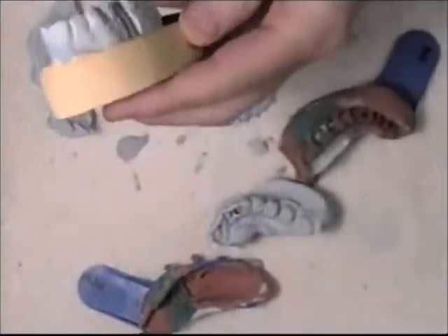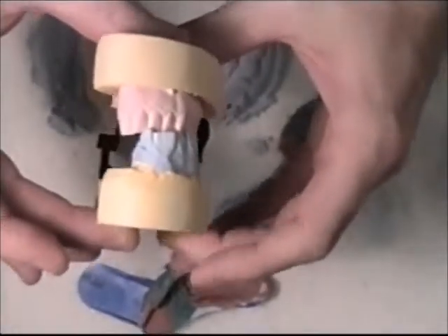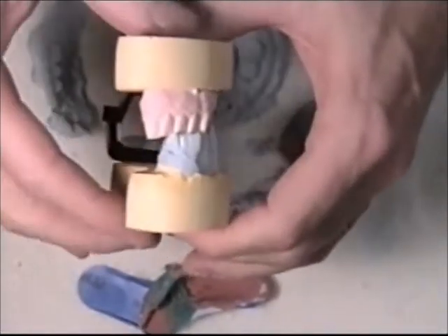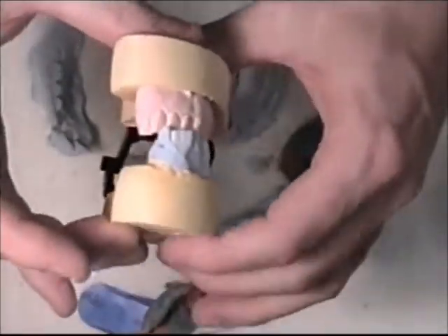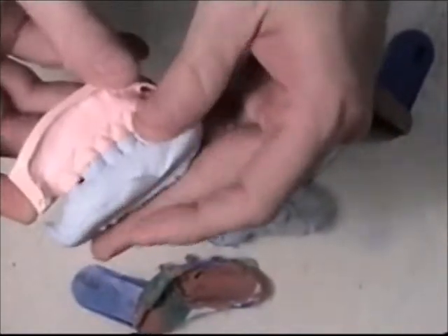Now I want to reference back to the completed model that I showed earlier. You can see how it's nice and level on the top and the bottom — parallel. In order to achieve that, we're going to have to make sure that the die model we just poured from our impression is level, along with its opposing model.